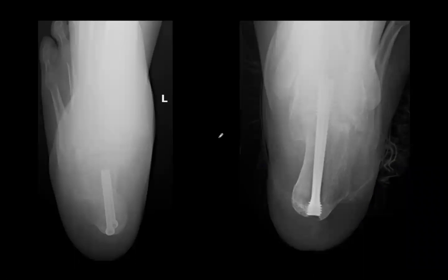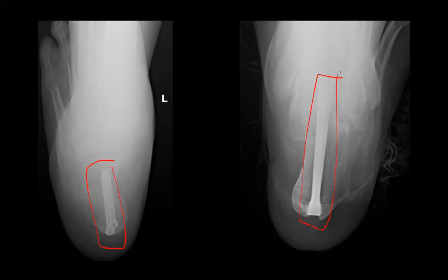Looking at two calcaneal axial images: on the left are two cannulated headed partially threaded screws for a calcaneal slide osteotomy. On the right are two cannulated partially threaded headless screws — no head present, threads instead. These gain compression because of different thread pitch distally versus proximally. Don't confuse headless compression screws with locking screws — this is a common mistake when first learning.